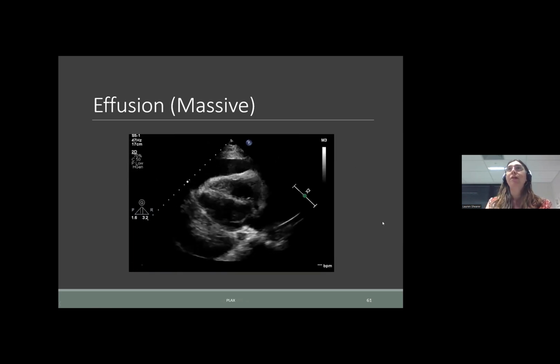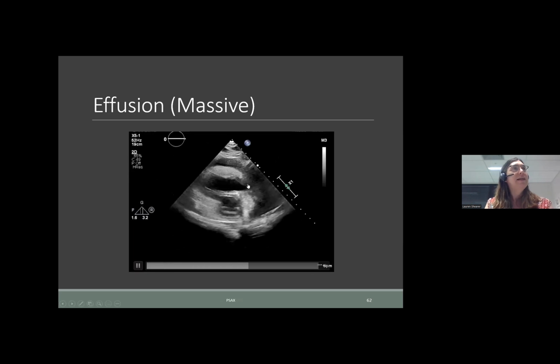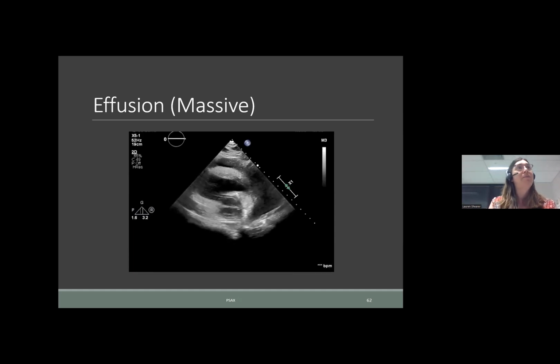As we move on to the short axis, again, the heart is sitting here. There are some other things going on with this heart that I won't necessarily talk through, but we are seeing some right heart dysfunction as well. And we see a size discrepancy here, which, as I mentioned, makes you need to think about those pulmonary emboli. But here is the heart, here is the pericardium. Hearts shouldn't be sitting in buckets of water.